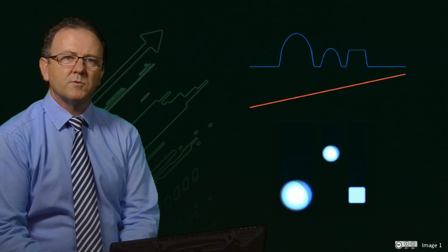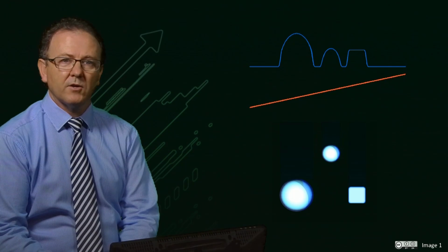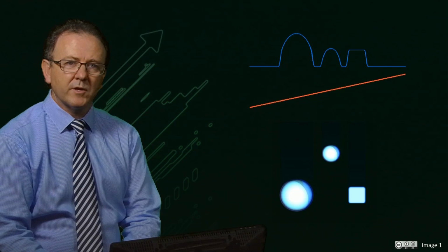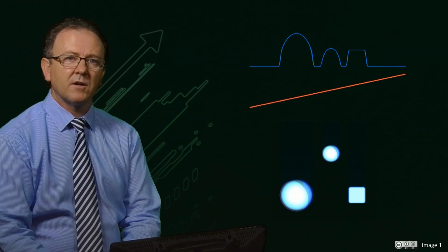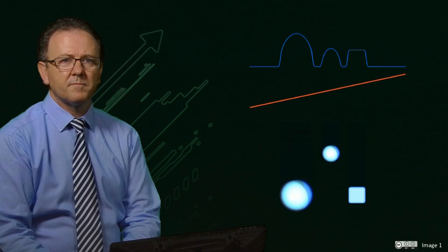We have three samples of water arranged in the magnet. A field gradient is applied along the horizontal direction. The frequency of the spins within the samples are therefore different and are encoded with increasing frequency from left to right. So the signal from each of the samples will occur at different frequencies, and within each sample, the shape of the signal will be a projection of the spin density against the horizontal axis as shown here. You can see that the projection reflects the shape of the object.